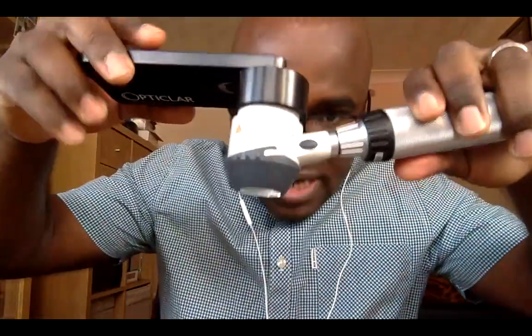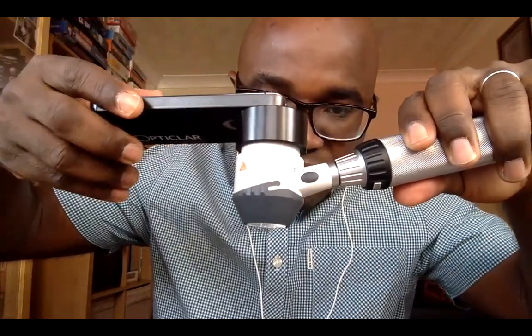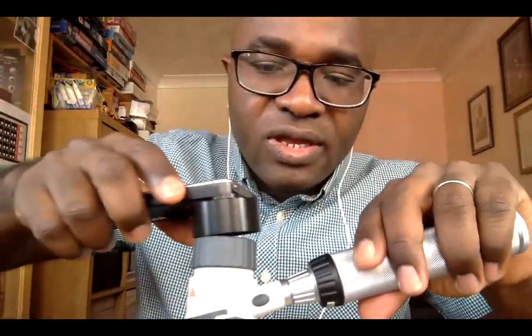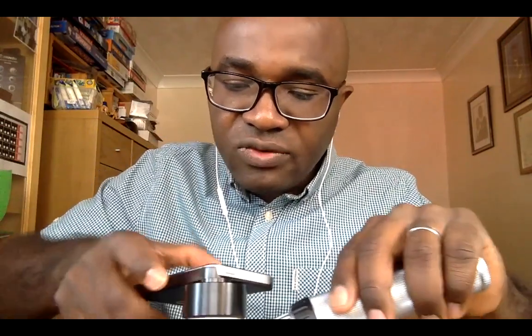It can also be attached to an iPhone, and I have an iPhone adapter here where you can attach your iPhone to the dermoscope that way and be able to take a picture of the image you're seeing. So you can look at it this way, or you can attach it this way where you can see the image on the phone. Okay, and if you go into your camera settings on the phone, it will show you through the dermoscope. So that's the Heine Delta 20.